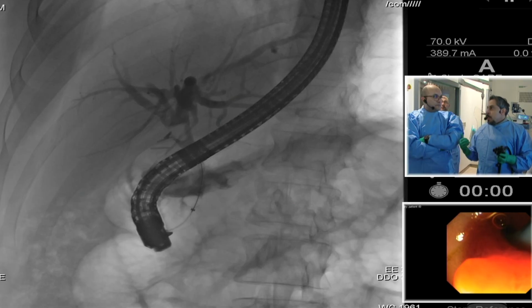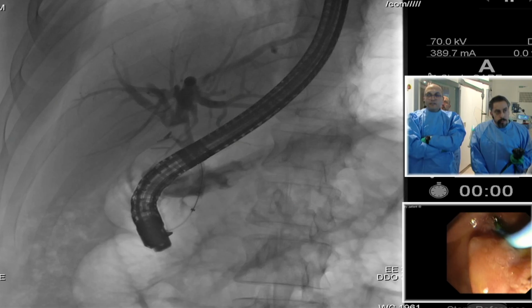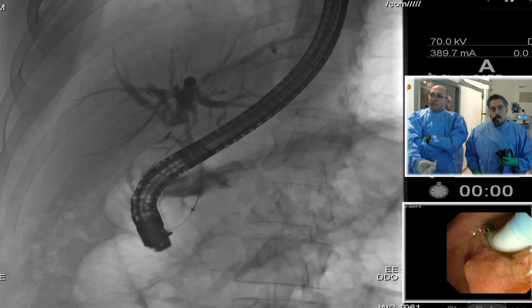Good. So, Dr. Bashir, what do you think? Usually we start with cholangioscope immediately? Dr. Hamad. So I was excellent. Is that a balloon inflated at the tip? Yes, the balloon is almost about 10 millimeter.